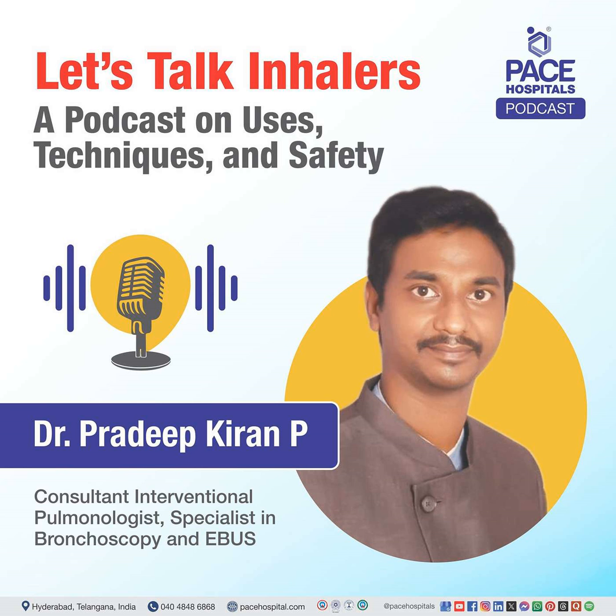So what will we do? The dry powder inhaler capsule which is there, you have to take that capsule, open this device, place that capsule in the space what you are visualizing. So once you place that capsule, again lock it. So after locking, the next step is, you can see two buttons here. You need to press these buttons.